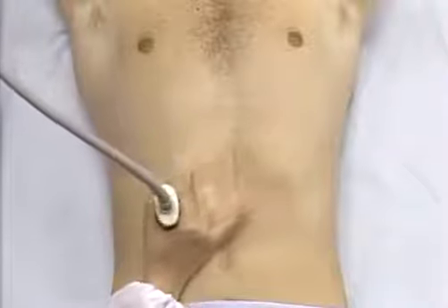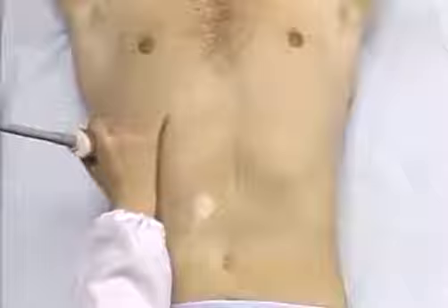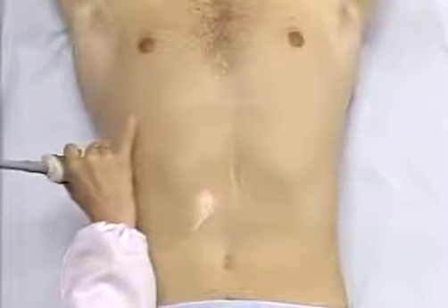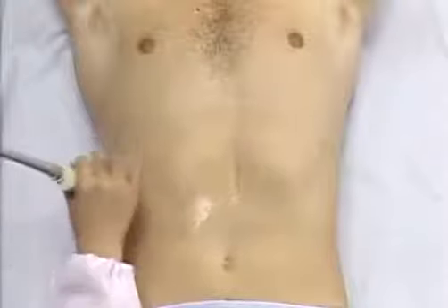What should we do to ensure a successful examination? Well, we must follow given procedures and examine the entire region of interest. We must not concentrate on the first lesion we encounter, otherwise we may miss a second or a third lesion. By scanning carefully, we can discover hidden lesions.